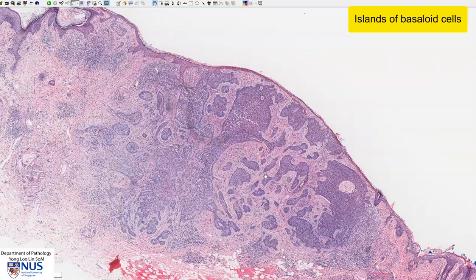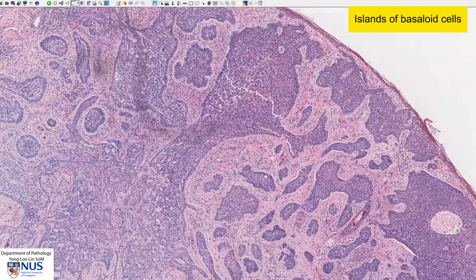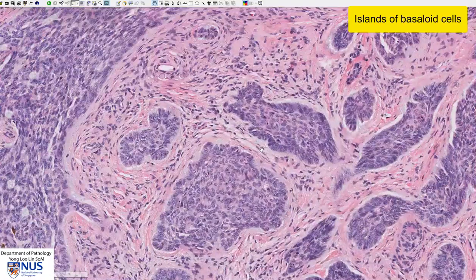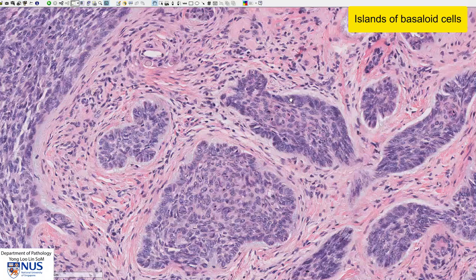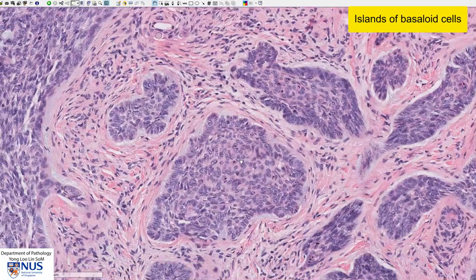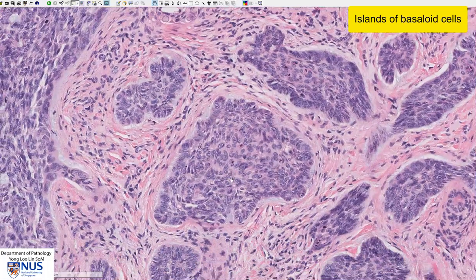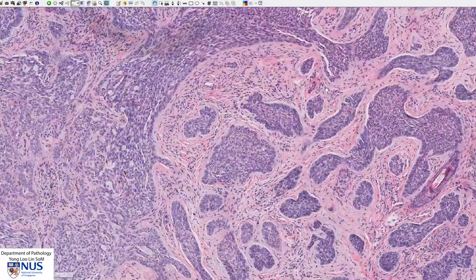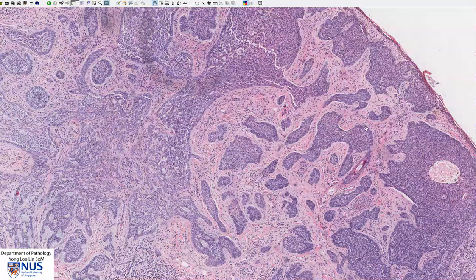When I say basaloid, this means that the nuclei are oval in shape, they are relatively uniform, and there is quite scant cytoplasm. So in other words, there are high NC ratios — high nuclear cytoplasmic ratios. So the tumour is composed of these geographic or irregular islands of basaloid cells.